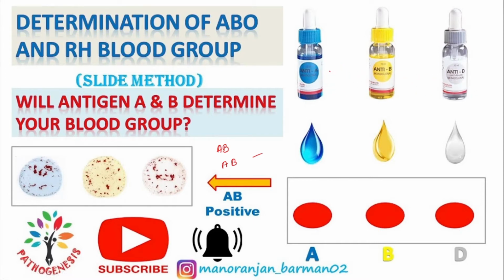Antisera A contains antibody A, antisera B contains antibody B, and antisera D contains antibody D. And we add each drop of this antisera to the blood drop taken on a labeled slide, labeled A, B and D. A is A antisera, B is B antisera, D is D antisera.